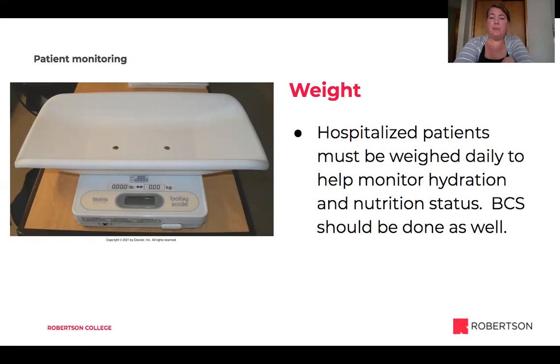Measuring patients' weights is going to help us to monitor if they're eating and drinking enough while they're hospitalized. We can also perform a BCS, or a body condition score. So if an animal is visibly losing weight, we're going to be concerned about that as well. So we do want to weigh patients and then record that in the file.